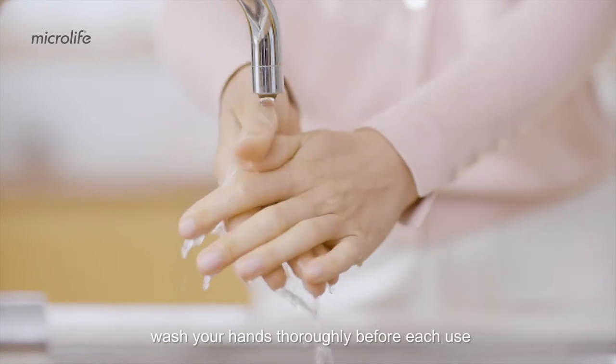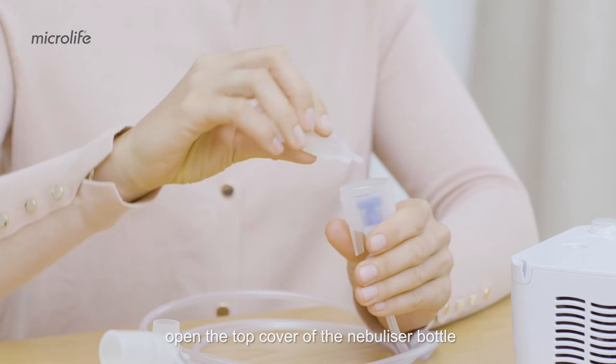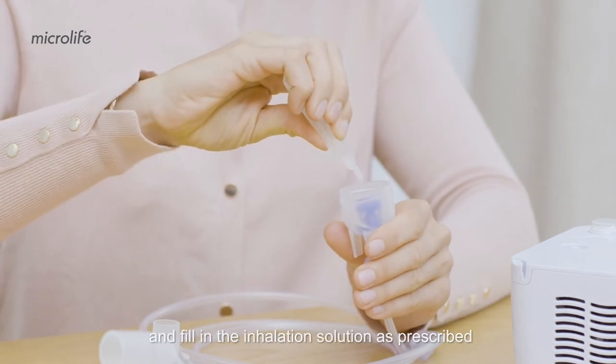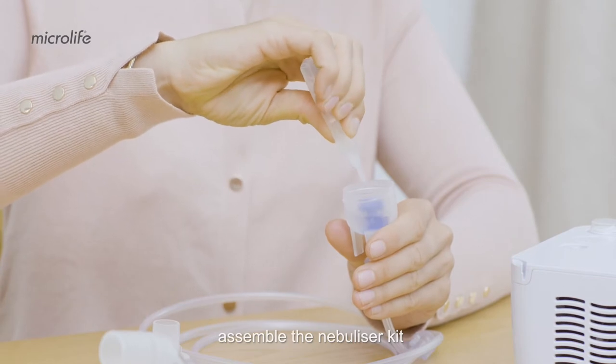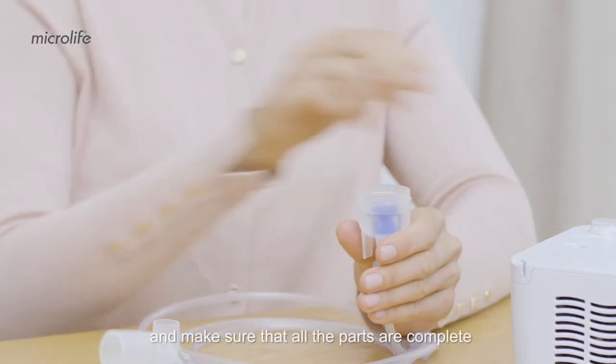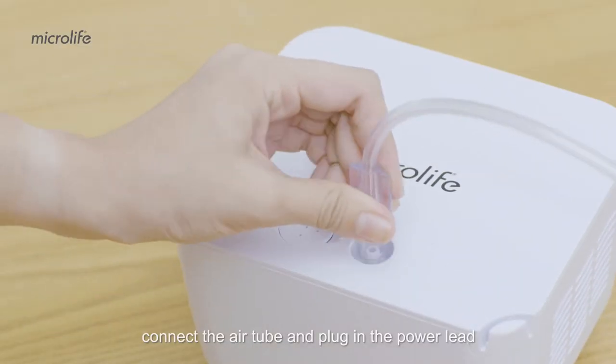Wash your hands thoroughly before each use. Open the top cover of the nebulizer bottle and fill in the inhalation solution as prescribed. Assemble the nebulizer kit and make sure that all the parts are complete. Connect the air tube and plug in the power lead.